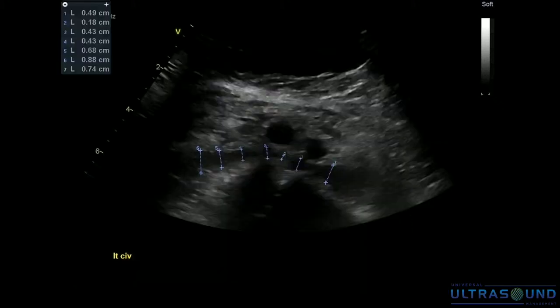So then I do additional measurements in B mode just to give the doctor good information, but I have to tell you, I did a lot more than I was supposed to on this one, just because I like to do more than I'm supposed to, I guess. But you could see pre and at the narrowest part of this, it's 1.8 millimeters, so it's really small, or 0.18 centimeters.